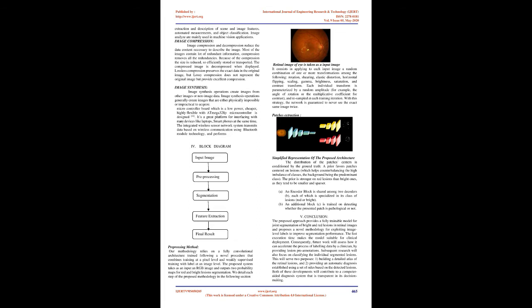3. Image processing techniques. This section gives various image processing techniques. Image enhancement. Image enhancement operations improve the qualities of an image, like improving the image's contrast and brightness characteristics, reducing its noise content, or sharpening the details. This just enhances the image and reveals the same information in a more understandable image. It does not add any information to it.